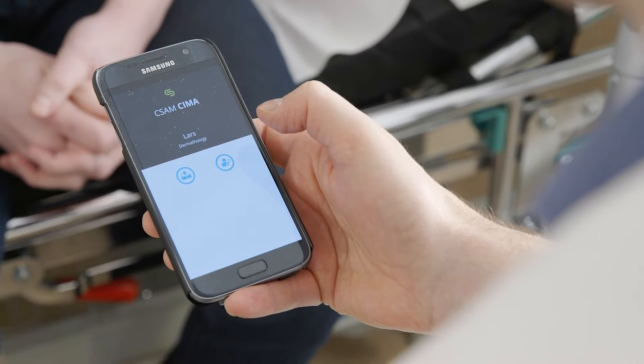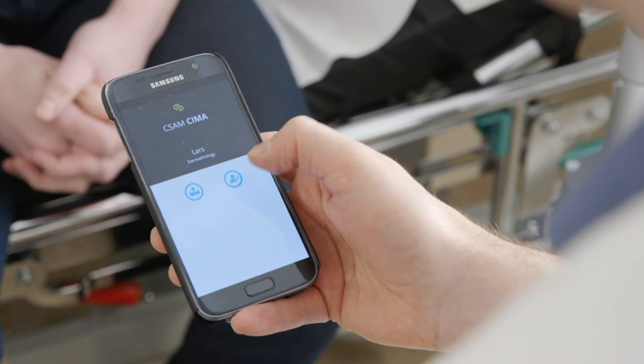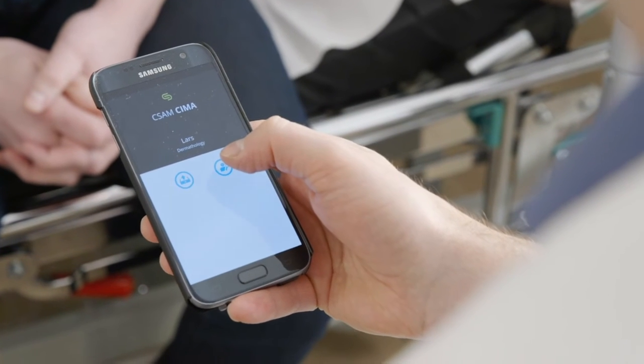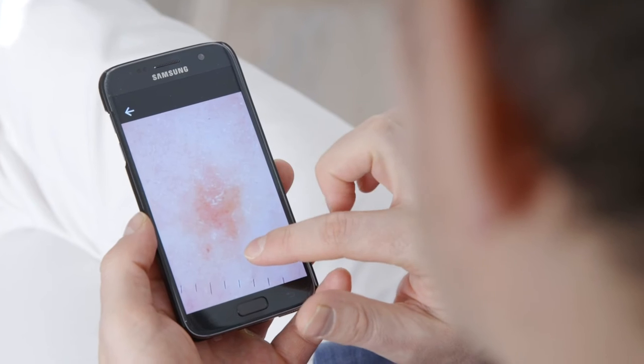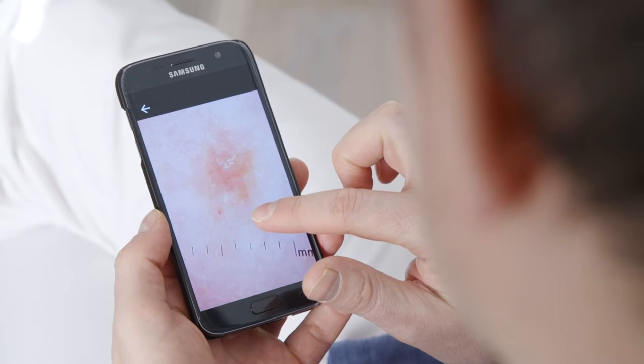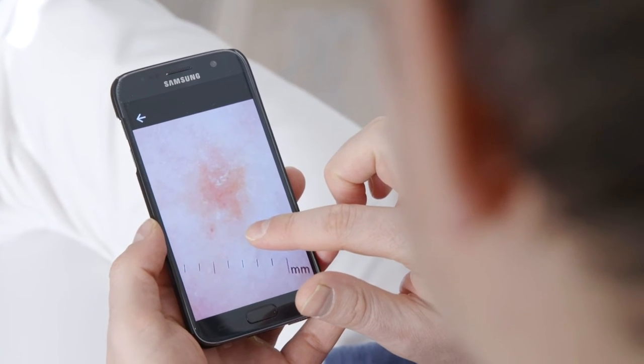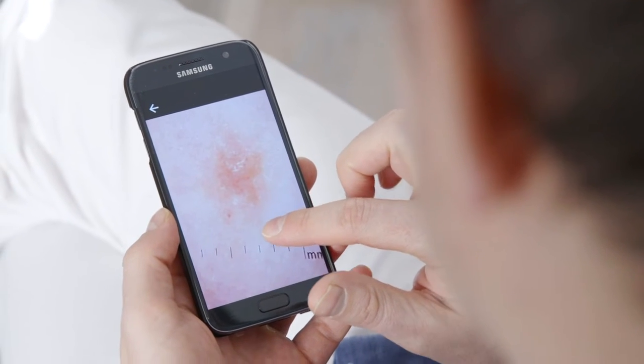Introducing the CIMA Clinical Imaging mobile application from CSAM. CIMA is designed to bring the power of medical imaging to your mobile device.